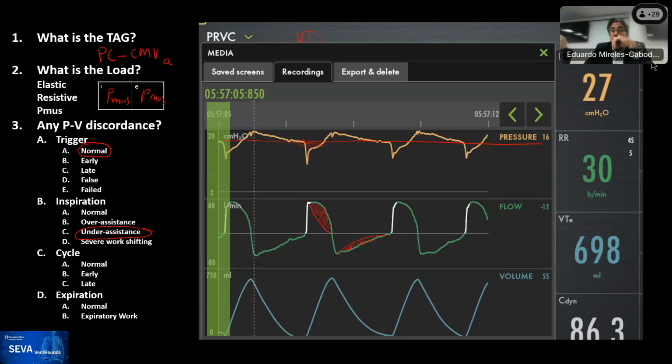And evidently at this time, we don't have perfect cutoffs and thresholds, but it's important to measure that we have some threshold that tells us that if the work is very high. So what would we use to assess the amount of Pmus that is occurring?